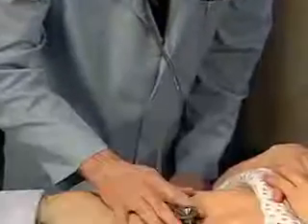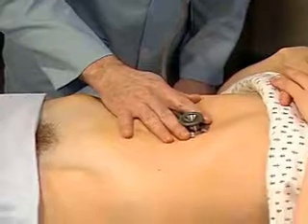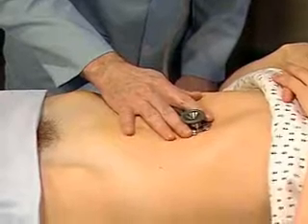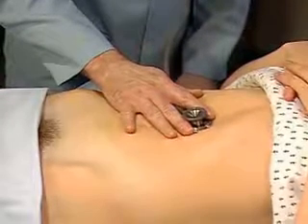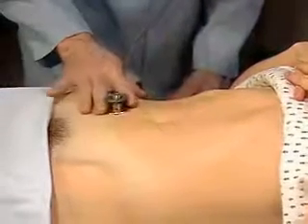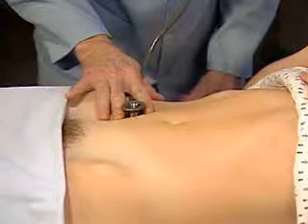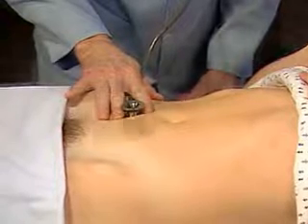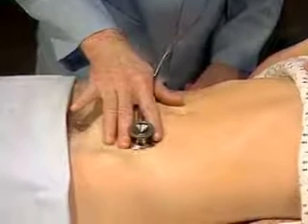If you suspect arterial insufficiency in the legs, listen for bruits over the aorta, right iliac artery, and left iliac artery.